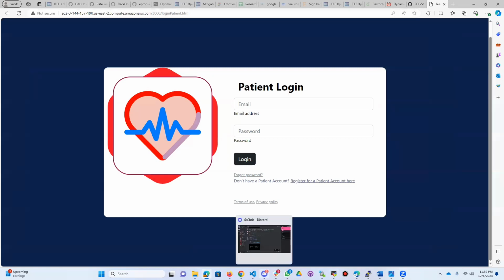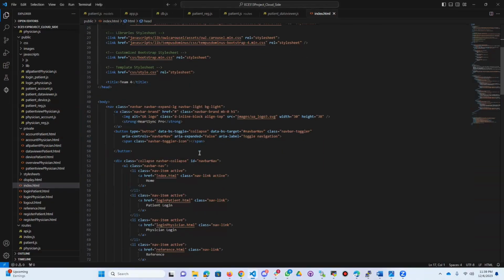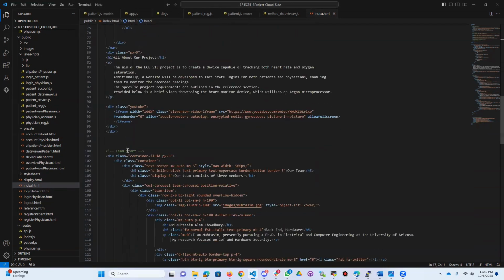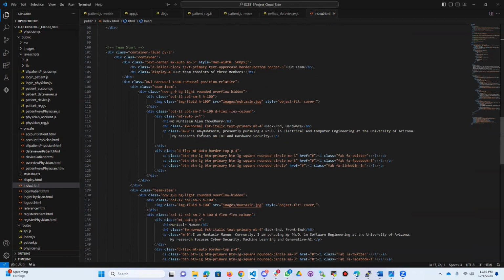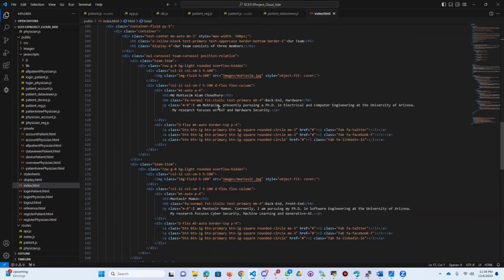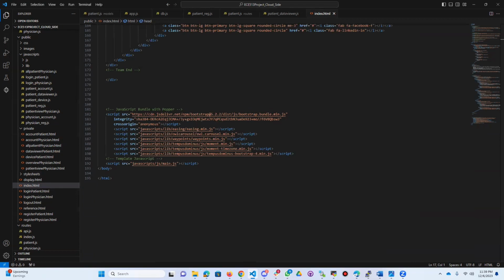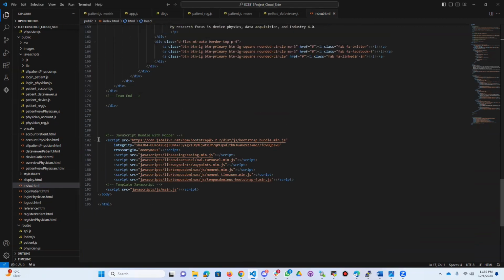I guess, yeah, open the VS Code here. So the body contains the project description, and the description of individual persons you can see here, and then it shows the JavaScript bundle and the template JavaScript here.